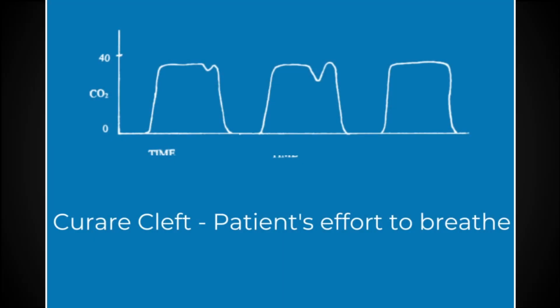I don't think you necessarily need to know this, but this is what's called a curare cleft, which is really more for medics. This is sedated patients that you have end tidal on when they start bucking the tube, right? If I give you paralytics, knock your respiratory drive out, and I take your airway away from you, and I keep ventilating you, it should look like clean ventilations. And if suddenly I start seeing these little jaunts in it, that's called a curare cleft, and it means your patient's coming back. It means they're starting to gain control of their own respiratory drive, and it probably means they need more good night juice, or else they're going to start choking on the tube you put into them.